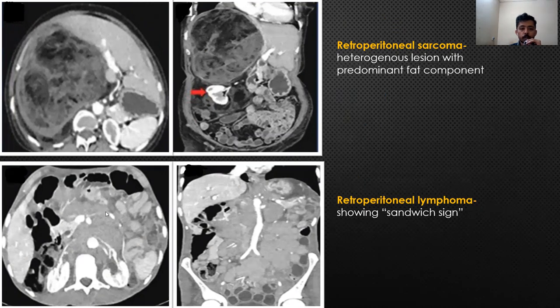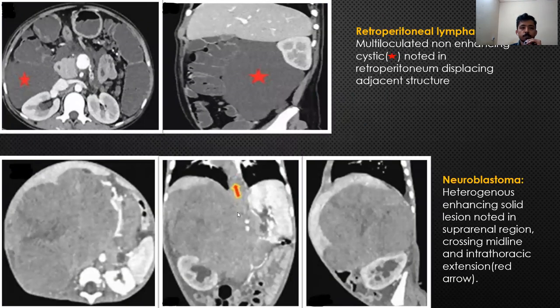Another case showed multiple homogeneously enhancing lesions of varying sizes noted in the para-aortic region, encasing the IVC and aorta, giving an appearance of a sandwich sign. It is a classical case of retroperitoneal lymphoma.